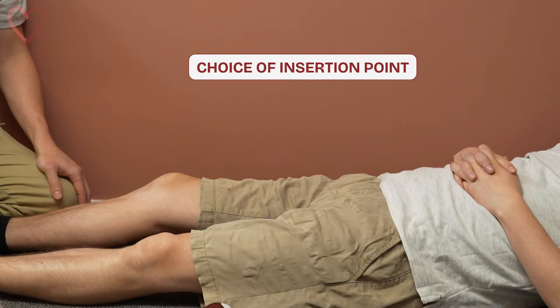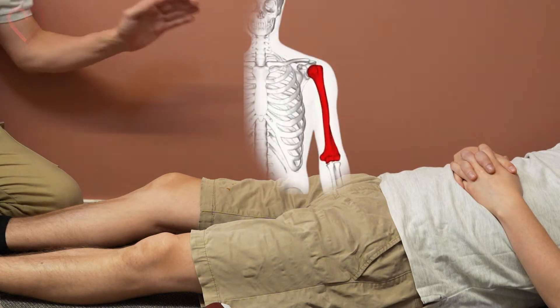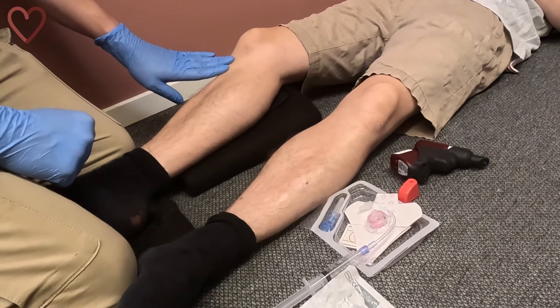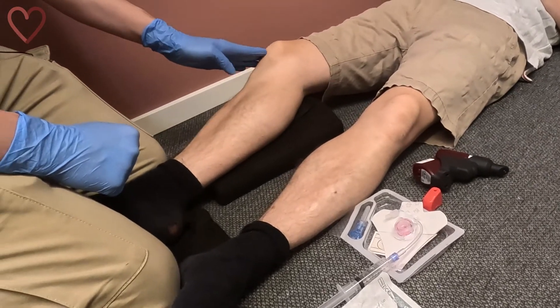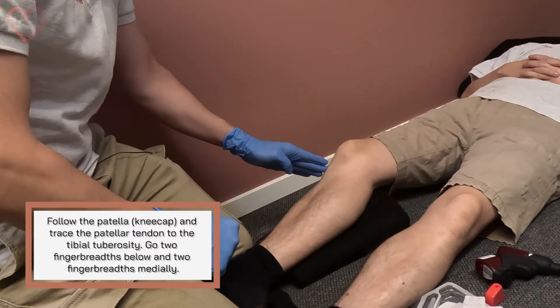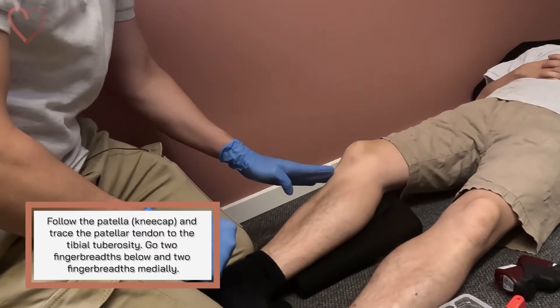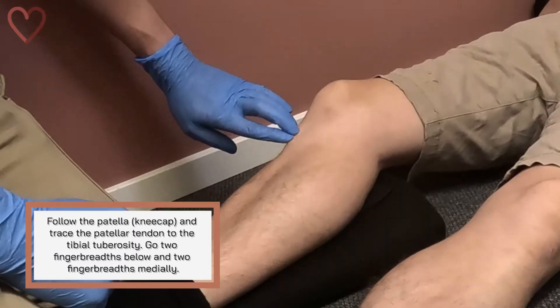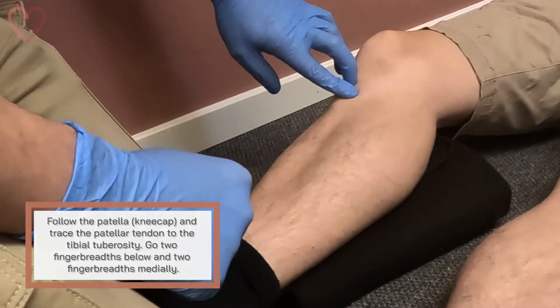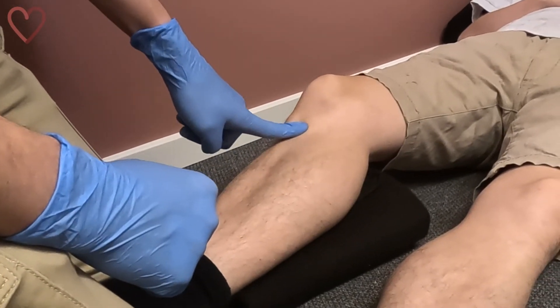There are several sites where you can establish intraosseous access, including the humerus, but today we'll focus on the tibial entry point. To locate the insertion site on the tibia, start at the patella and follow its tendon down to its insertion point. You'll notice a bump — the tibial tuberosity. Two finger widths below and two finger widths medially to that bump, you'll find a relatively flat area on the tibia.